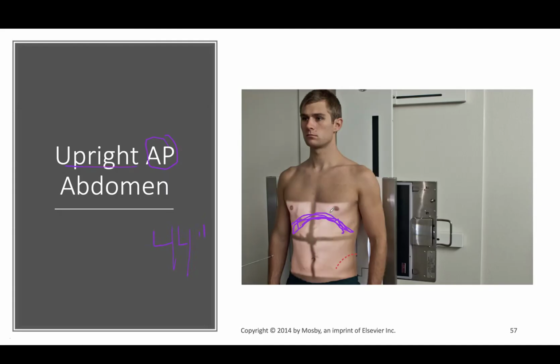The patient is not shielded, and make sure they've removed everything in the area, like a belly button ring, if that comes out. If it cannot come out, document that along with the patient information. Then your patient, their back is up against the wall bucky. Here we have the IR. We're using a CR system, so computed radiography, which uses an IR plate here.